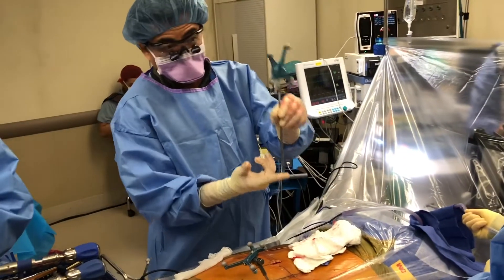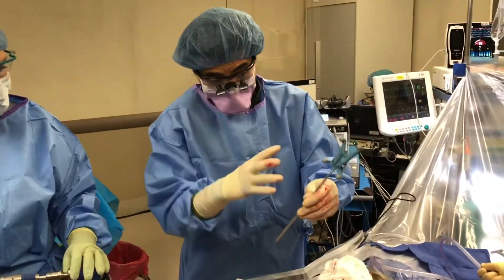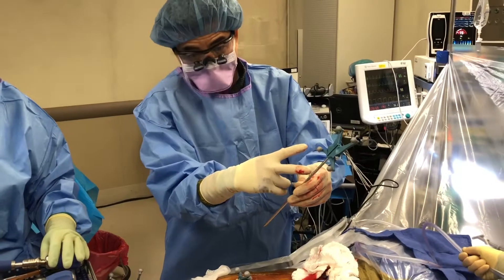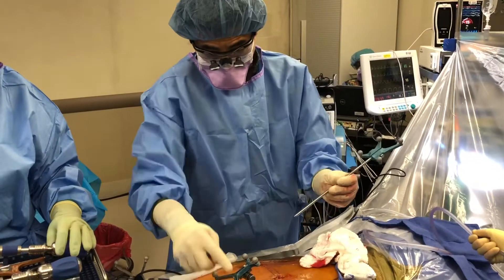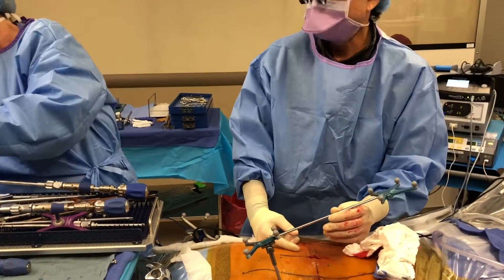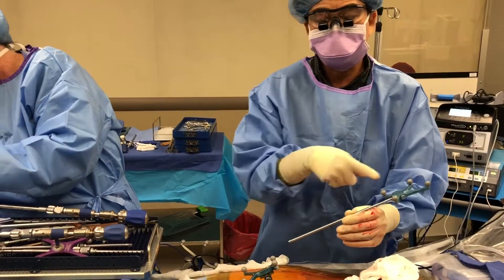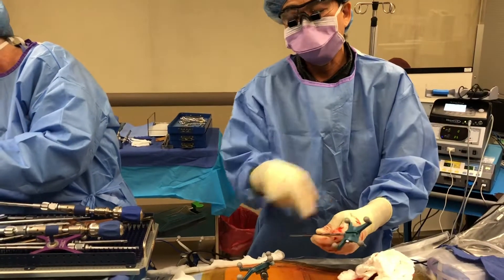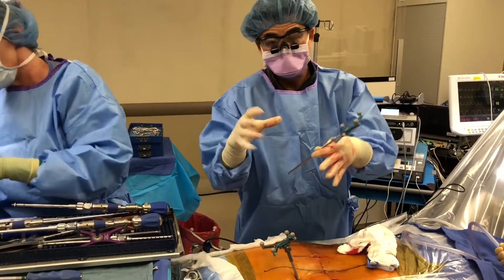This is one of many instruments that navigate the instrument. The first thing I do is reconfirm that the integrity of the navigation system is working. That means the relationship between this and this relative to this should be within one to two millimeters. And it'll beep — confirming that the 3D spacing of all the navigation instruments is intact.